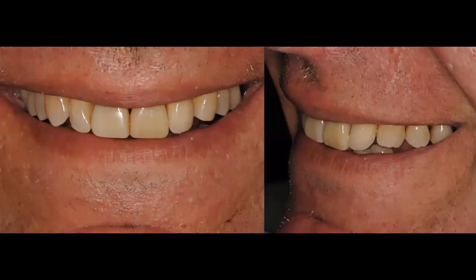Now you can see the patient had a low smile line, so the gingival defect, or the recession that we had on that side, was not even visible when the patient would smile. But I want you to see the biointegration, the way that we were able to match that lateral incisor to his contralateral incisor. And I want you to look at both 8 and 9 resin composites, the mesial distal width and the anatomy that we were able to achieve in our composite that you can see on this side view photo were ideal for this patient.